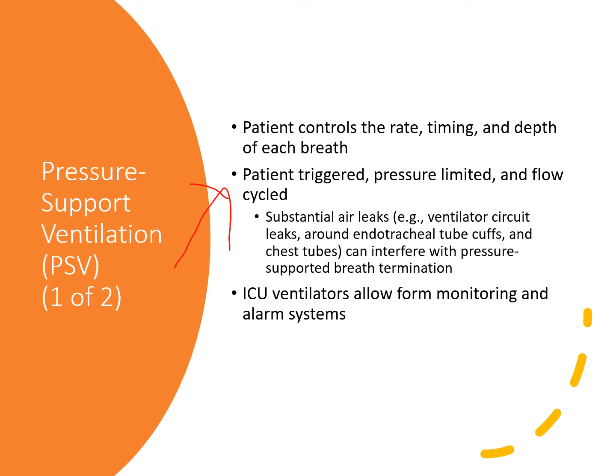I would say no. If they're using a ton of accessory muscles, do you have the right amount of pressure support? I would say no. All right, so that's something that you'll have to look for when you use this mode, and that can help you titrate up or titrate down your level of pressure support.